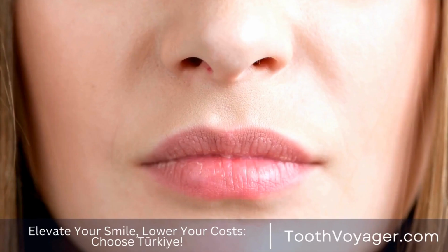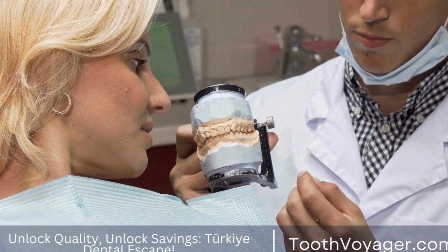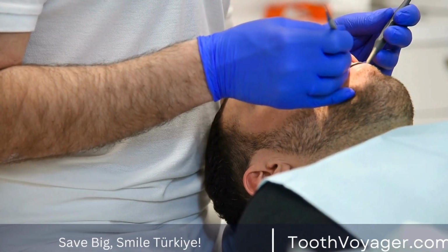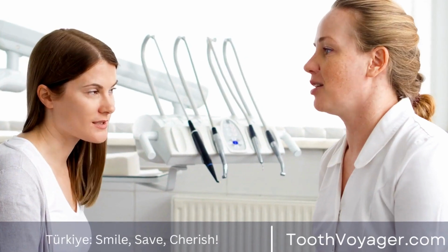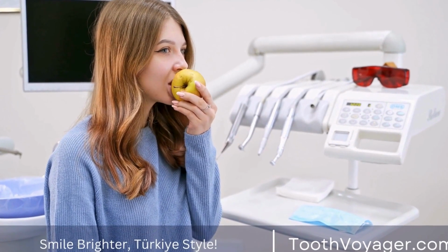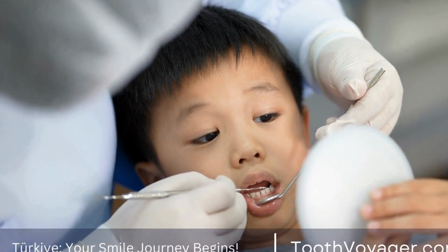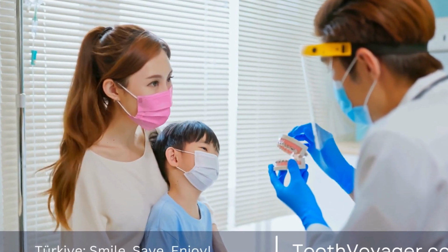1. Traditional dental implants. The traditional dental implant is the most frequently used kind of implant, with the highest success rate, which is up to 98%. They comprise three primary parts: the implant, the abutment, and the crown. Implants are surgically inserted within the jawbone. There, the implant joins with the bone over time to form a stable foundation to support the replacement tooth. The abutment, once attached, is bonded to the implant.